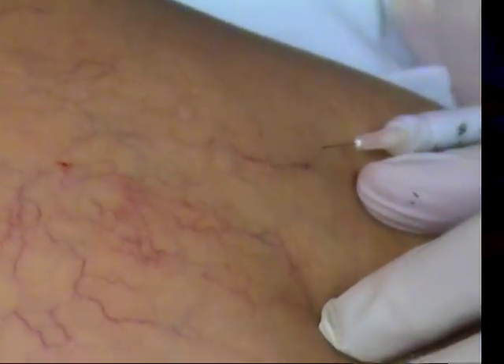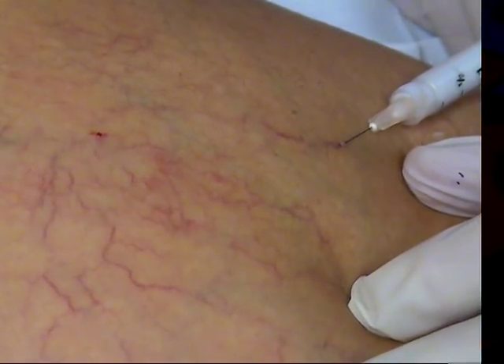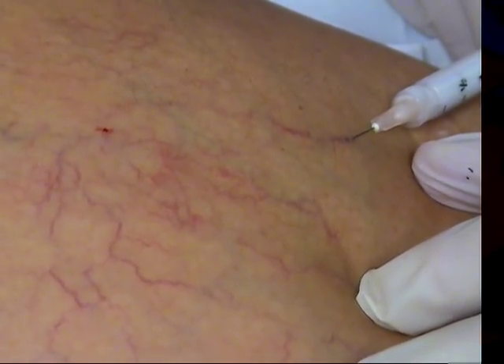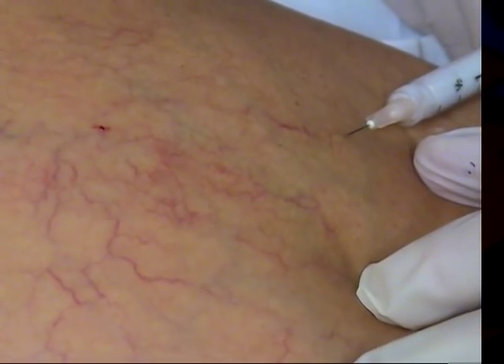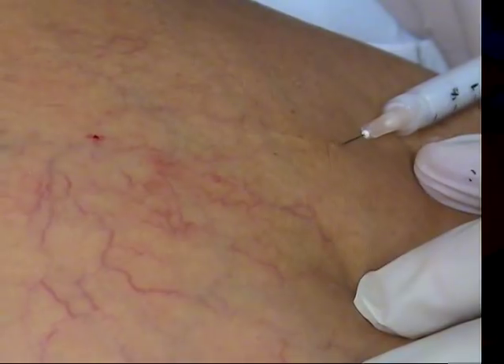Always want to try and inject uphill. Inject uphill. One needle coming in. See that? Just that foam gradually working its way up here.